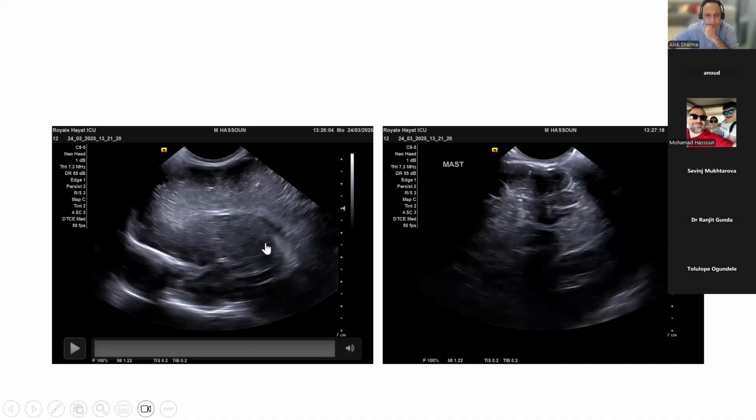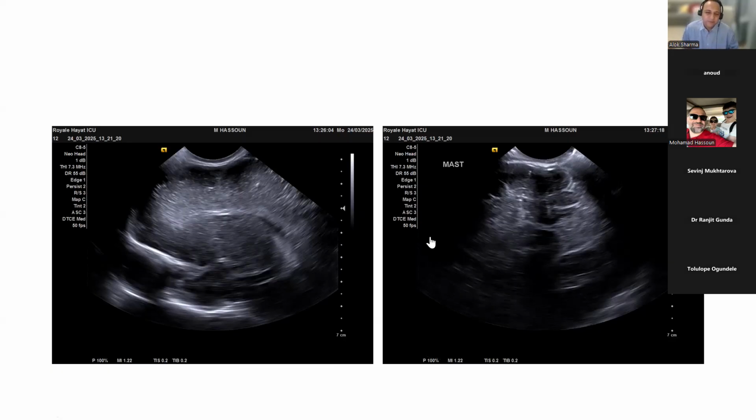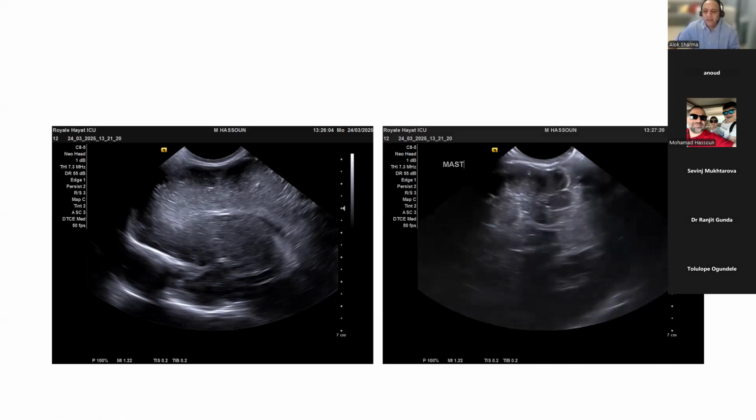Here I tried to do one mastoid axial, but I cannot interpret it. So this is the one I did, but I don't know what I see on this view. It's a little bit tricky. My gut feeling, if I have a go at this, is that you're probably seeing the temporal lobes coming in here and the cerebellum starting to appear.